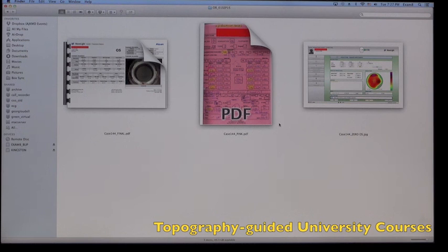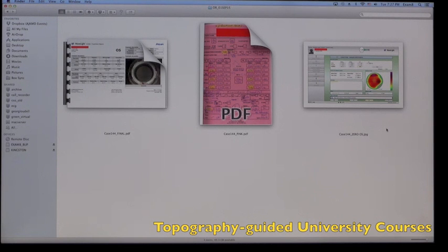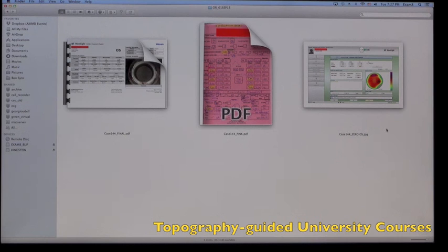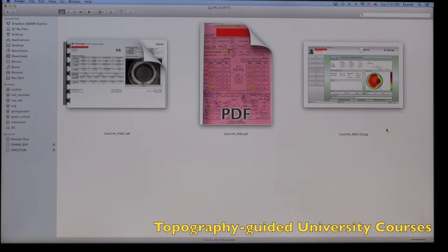On the right-hand side, we can see we've included for each patient the topography-guided plan if we had imported the placido disc topography into the Wavelight treatment platform with all refraction chosen to be zero.